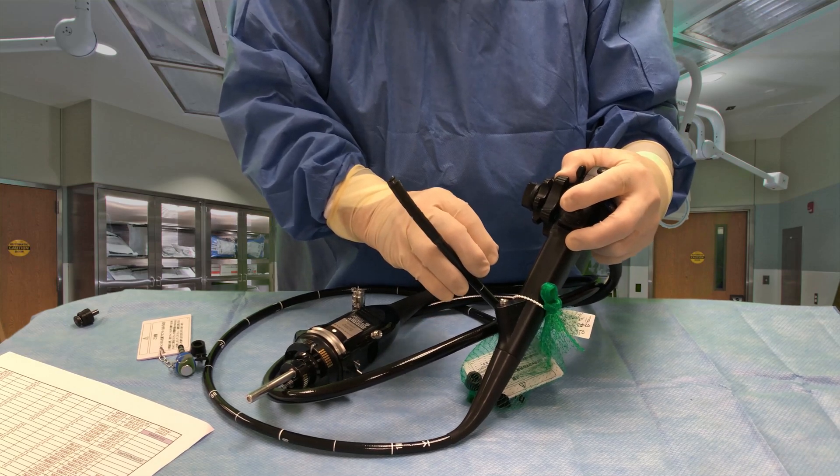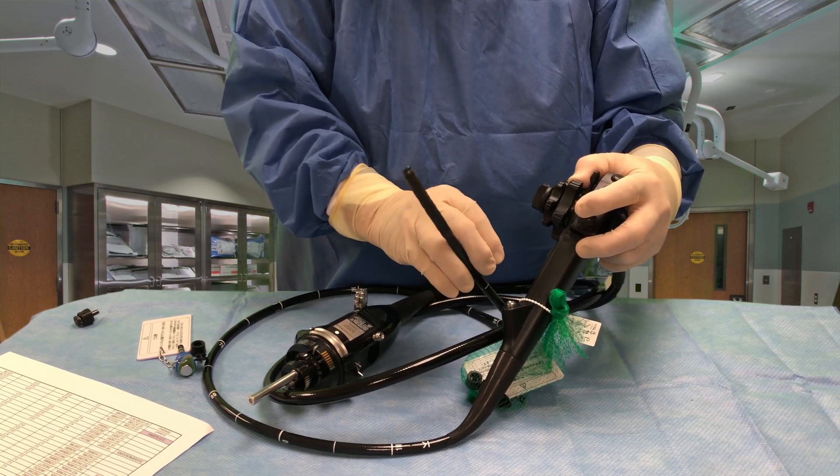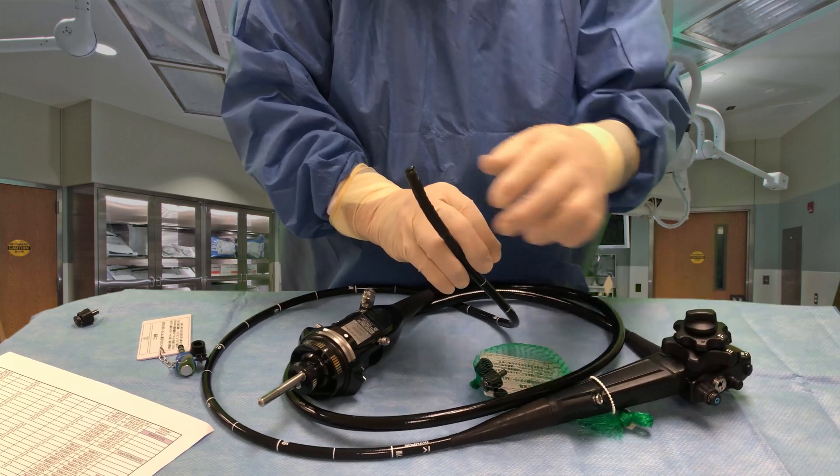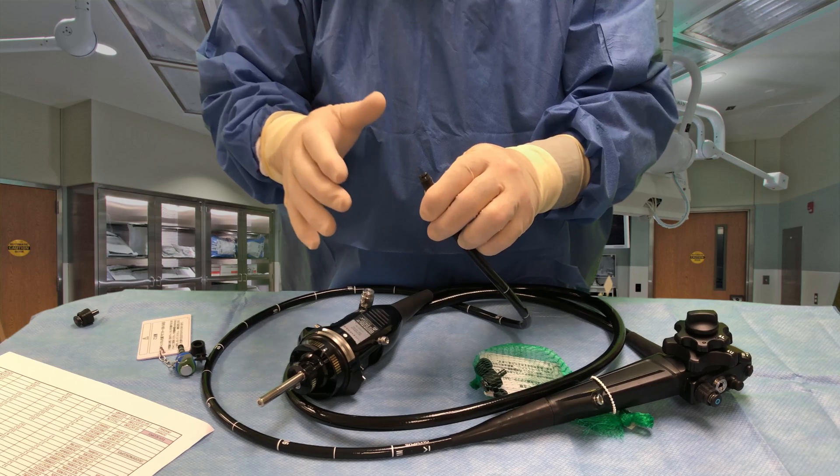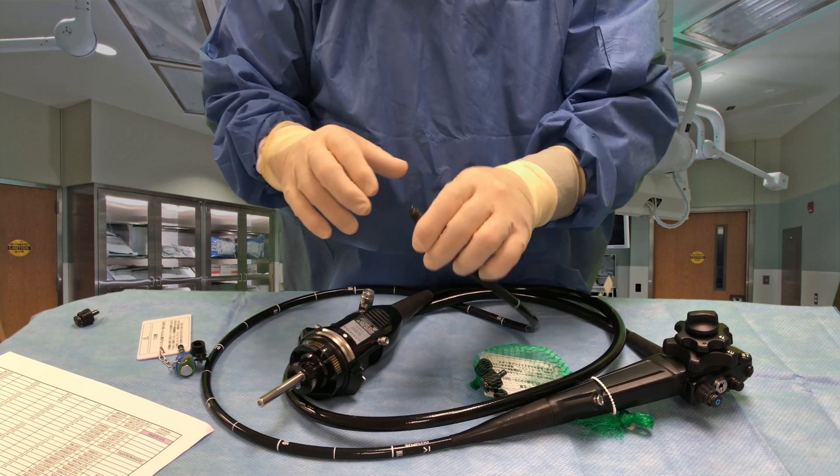If I press the button all the way down, it's going to send water squirting from the nozzle over the top of the lens to keep it clear so you can see where you're going. It's like a windshield wiper, basically.